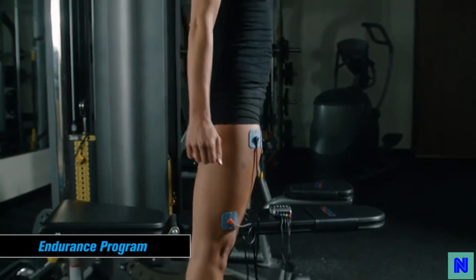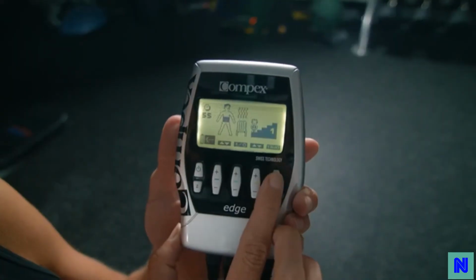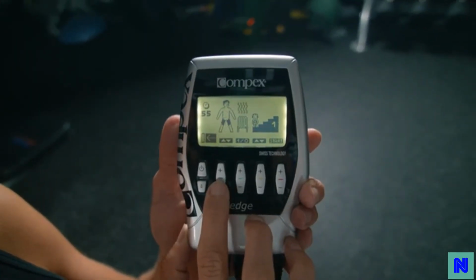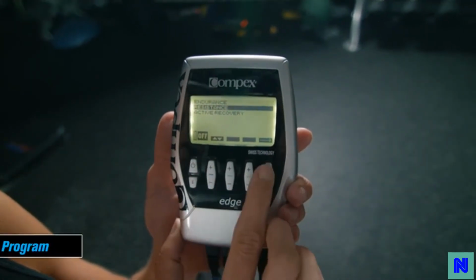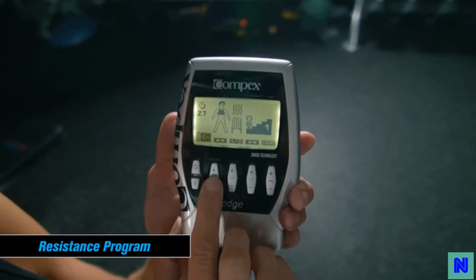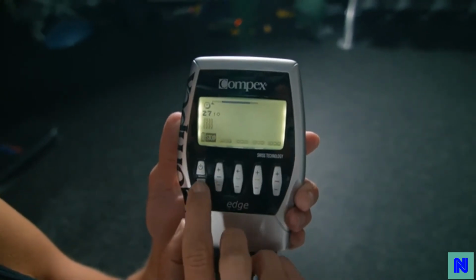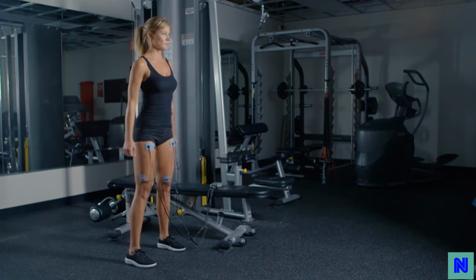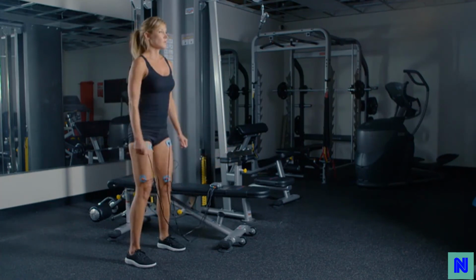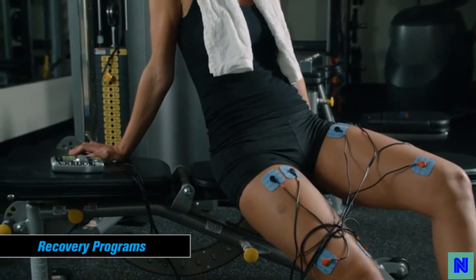The Endurance program is a 55-minute program that targets the slow twitch muscle fibers. The frequency starts low and gradually increases at each level during the program, training your muscles for long duration work. The Resistance program is a 28-minute program that trains the mid-range muscle fibers. This is a good all-around program to target overall muscle strength. Contraction times remain the same throughout the program, but the rest time gradually decreases depending on what resistance level you are on. Recovery is essential to any training plan.